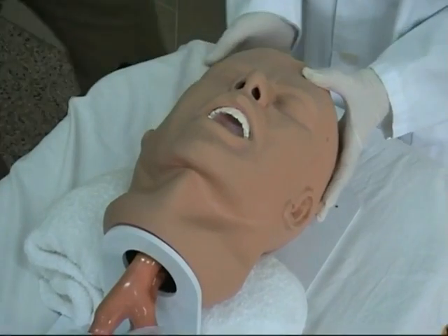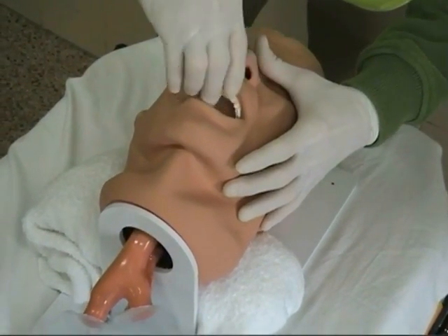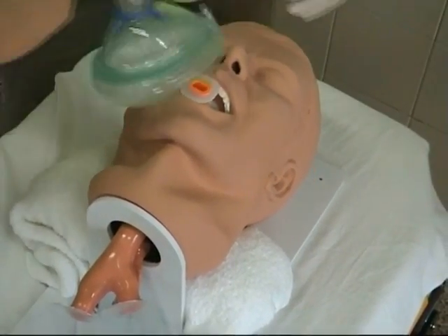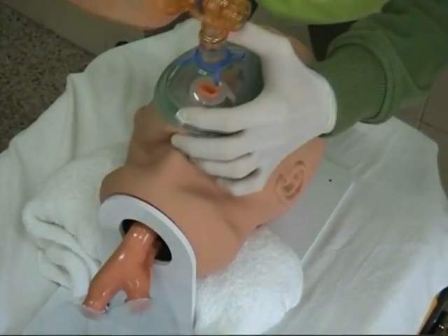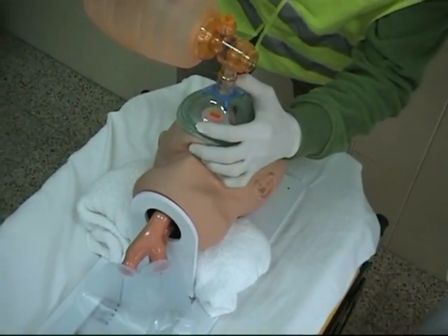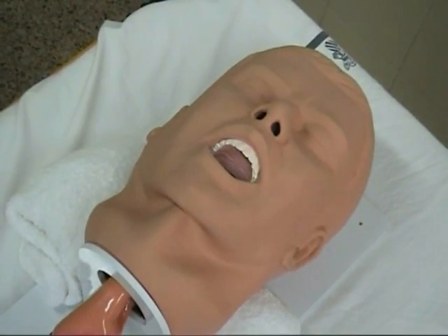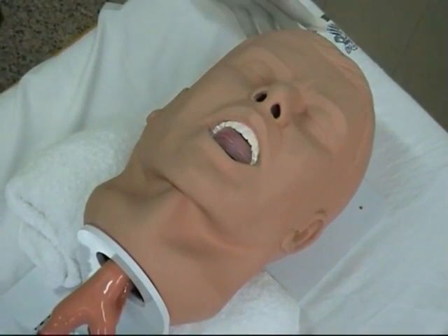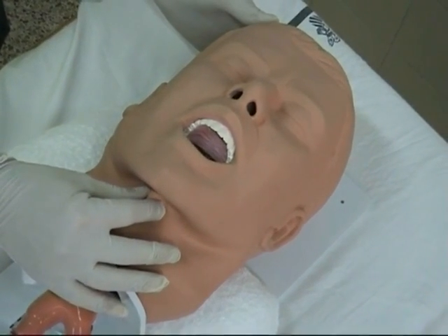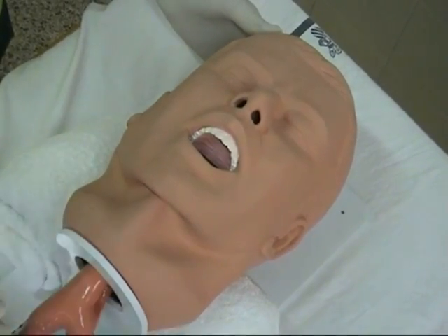In a real patient, we should pre-oxygenate the patient with a bag valve mask attached to oxygen for at least 3 minutes. An assistant should perform Sellick maneuver by applying a firm pressure on the cricoid cartilage to prevent the regurgitation of gastric content to the airway.